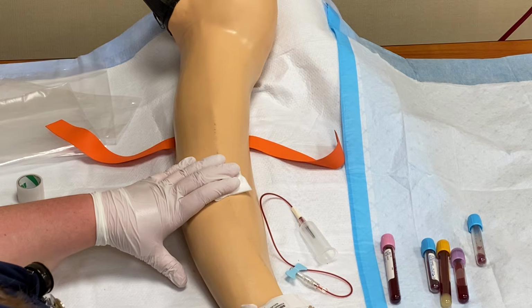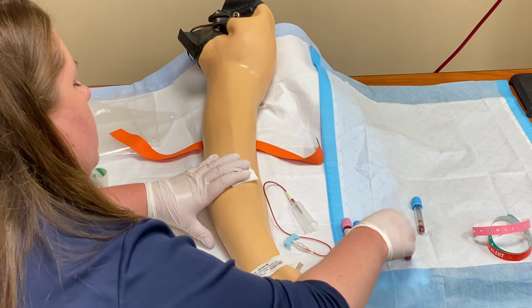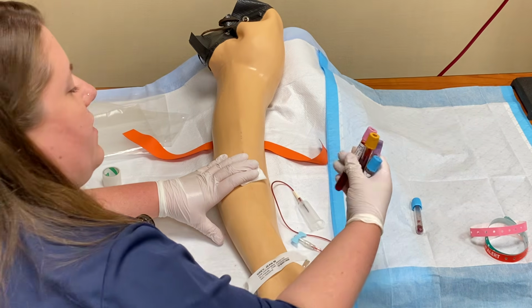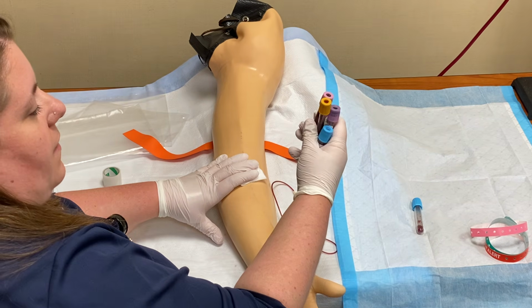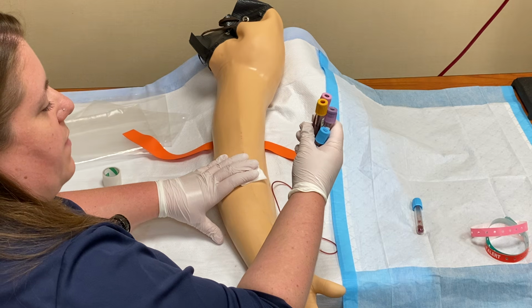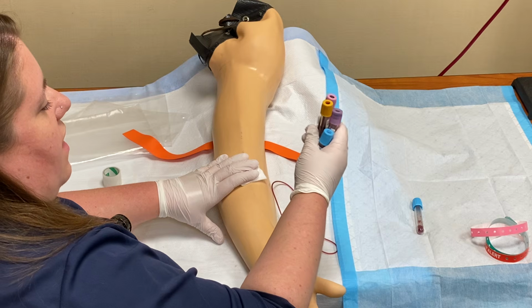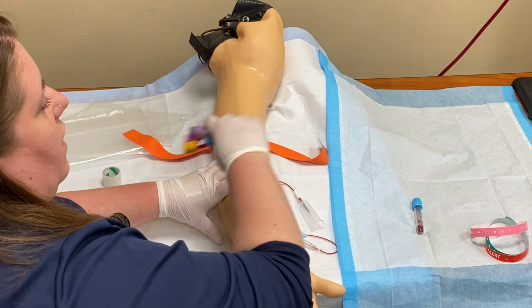My patient's on anticoagulation, so I'm gonna hold pressure for 3 to 5 minutes. I wanna pick up all of my tubes and I wanna invert them correctly. So my blue tube is inverted 4 times, my gold 5, and my lavender and pink 8 times. So we're gonna do that together.